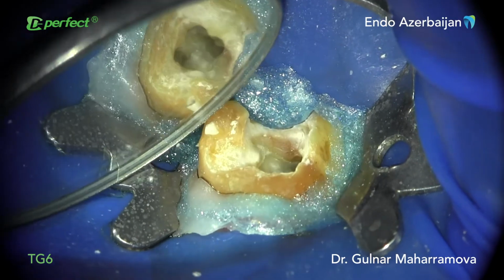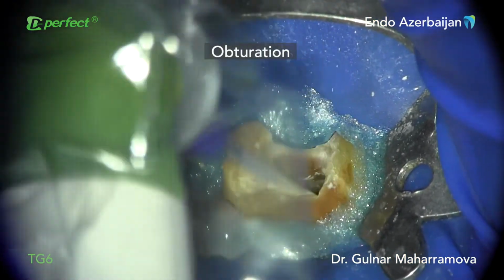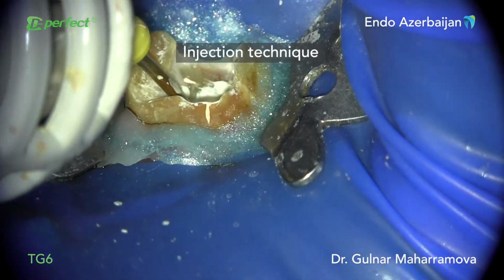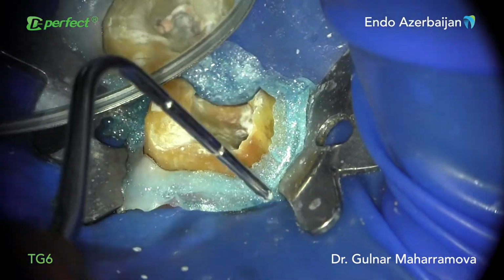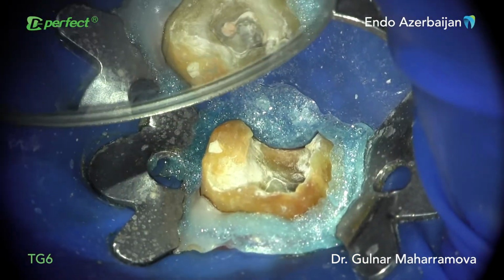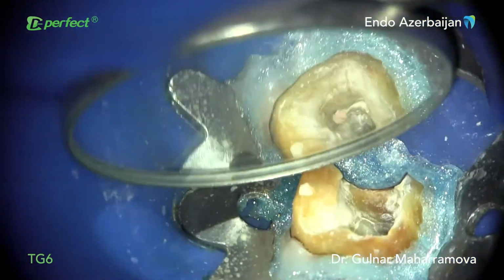After the irrigation, the canal space was dried and the sealer was placed. According to irregularities and complexity of a root canal space, in this specific case, I used injection of warm gutta percha to get a better sealing and obturation. Finally, when the access cavity is cleaned from excess of gutta percha and sealer, the patient can proceed with the restoration.